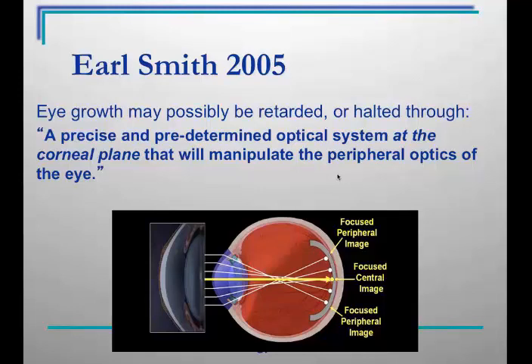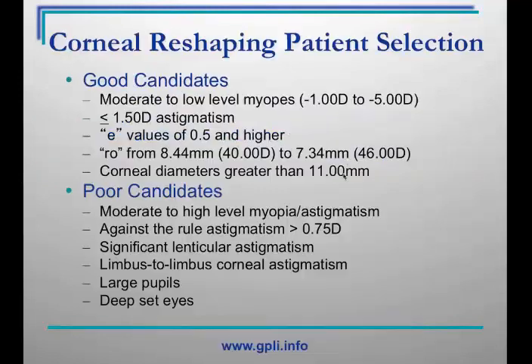And that's what we're finding not only in corneal reshaping designs, but also in some new and exciting custom soft designs. So who are good candidates for corneal reshaping?